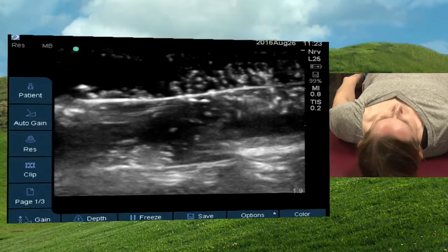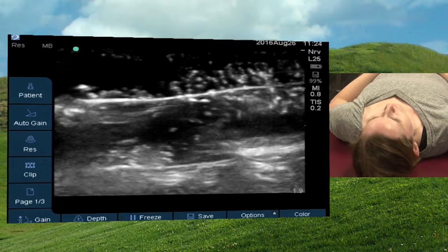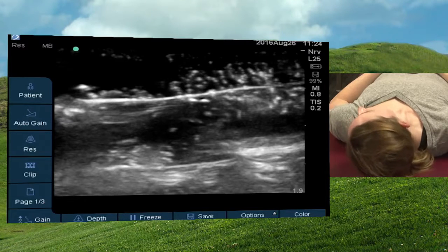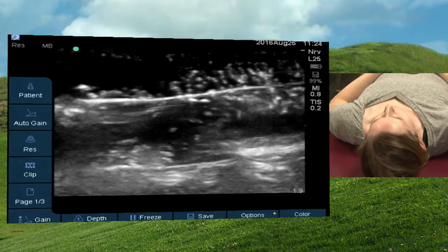Yes. Have you ever seen a clot or embolus form doing IJ or EJ access? Like on the tip of the catheter, or multiple accessing, or do you mean a hematoma versus a clot?